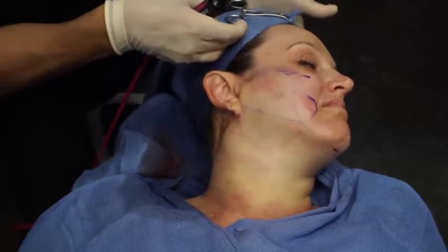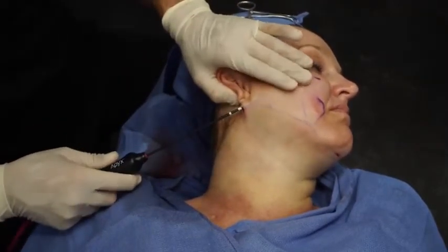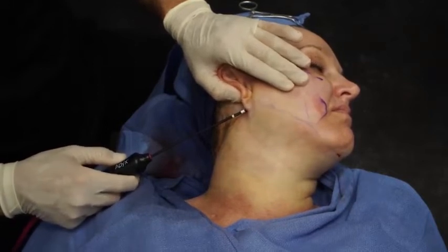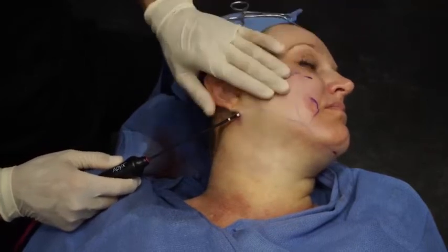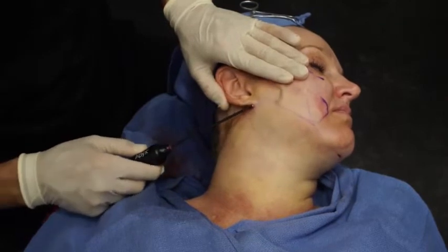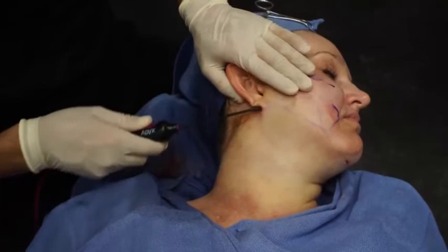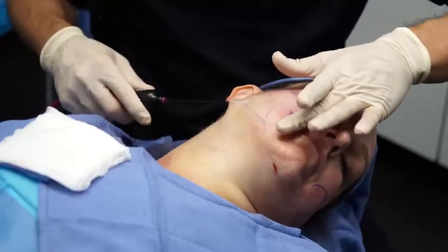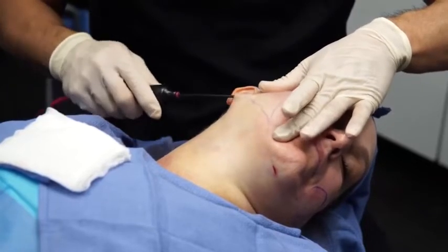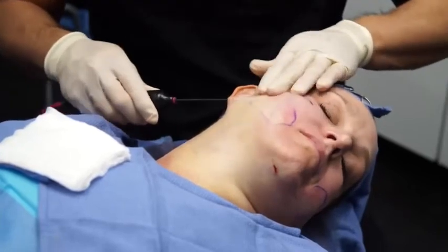Now we're going to redirect our attention to the jowl. We're going to go into our port again, double check and make sure that there's egress posteriorly. And there is. You don't see the significant inflammation or emphysema occurring. And we're just going to walk this up and bring it into a retrograde fashion. Additionally, you can go ahead and use pressure on the distal aspect of your treatment zone to prevent gas egress into the areas that you're not wanting to treat.